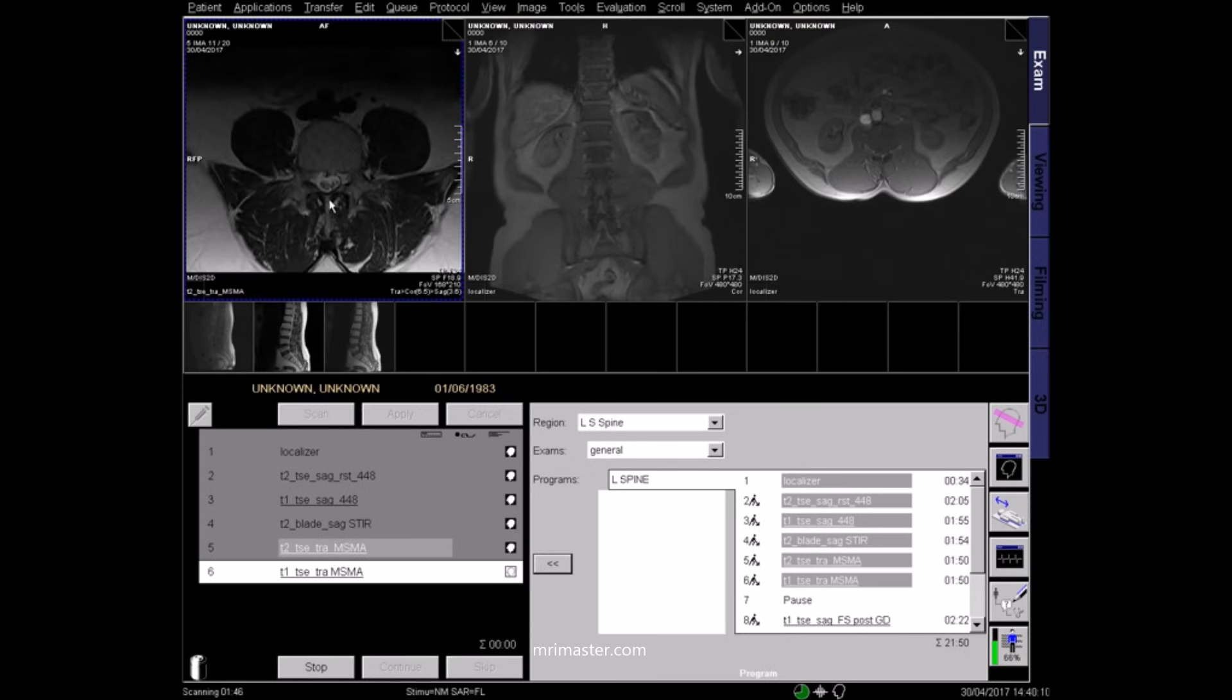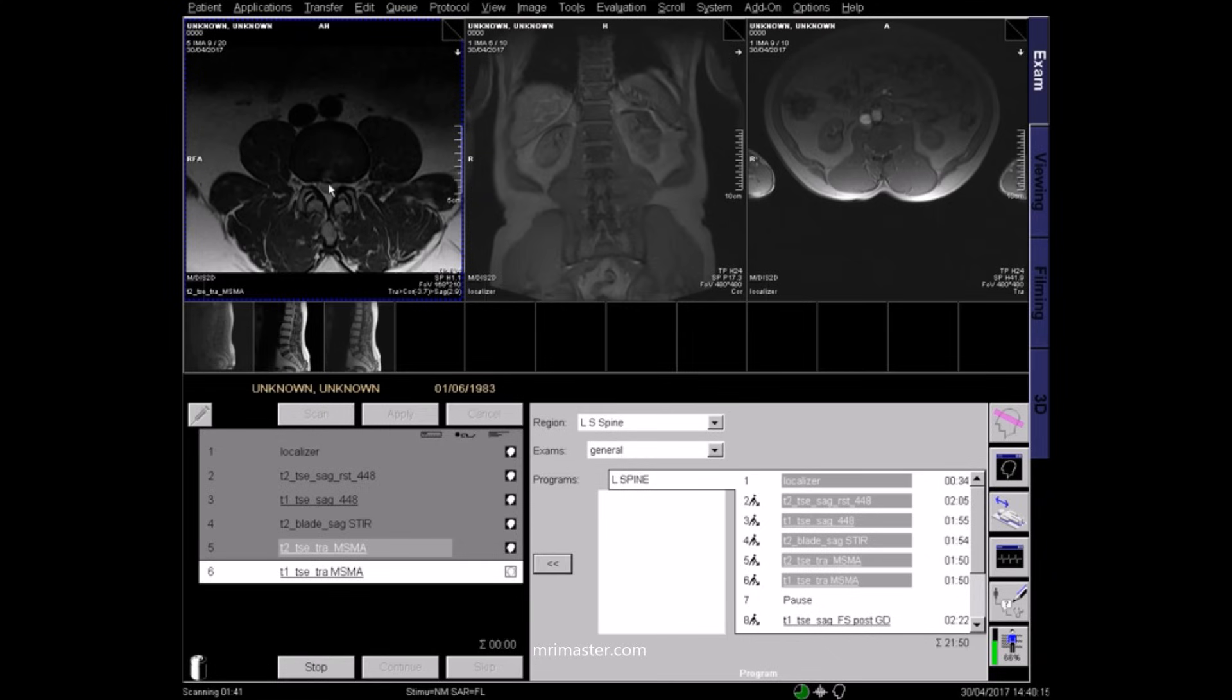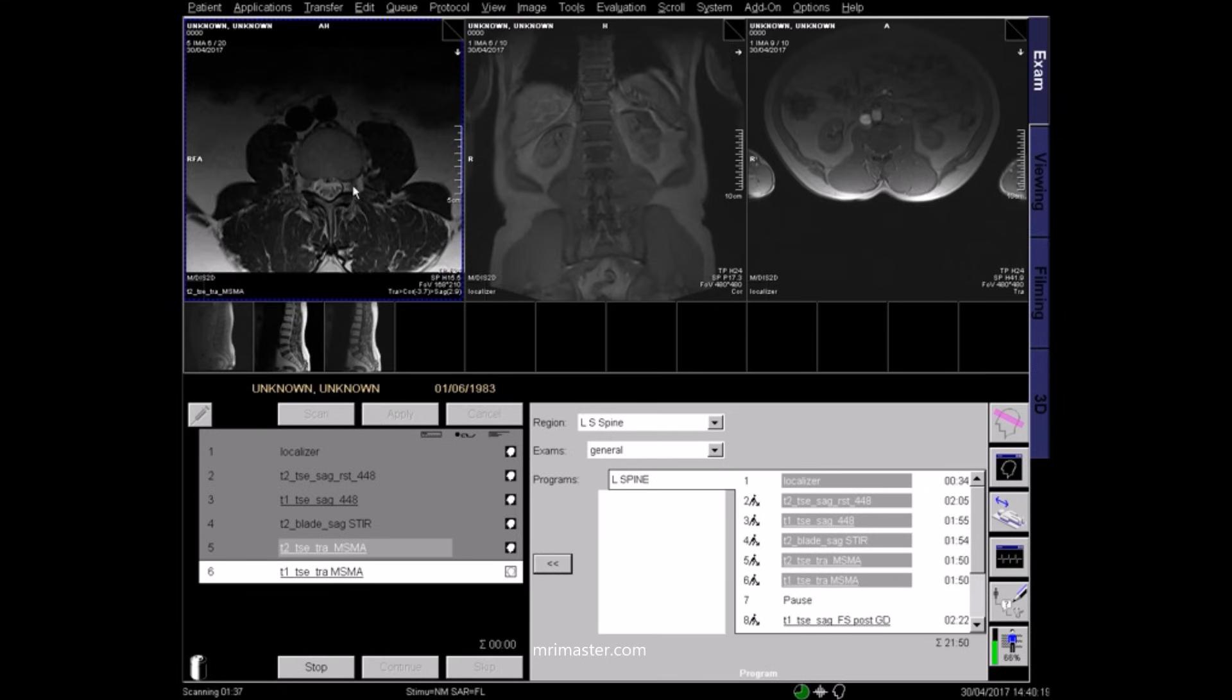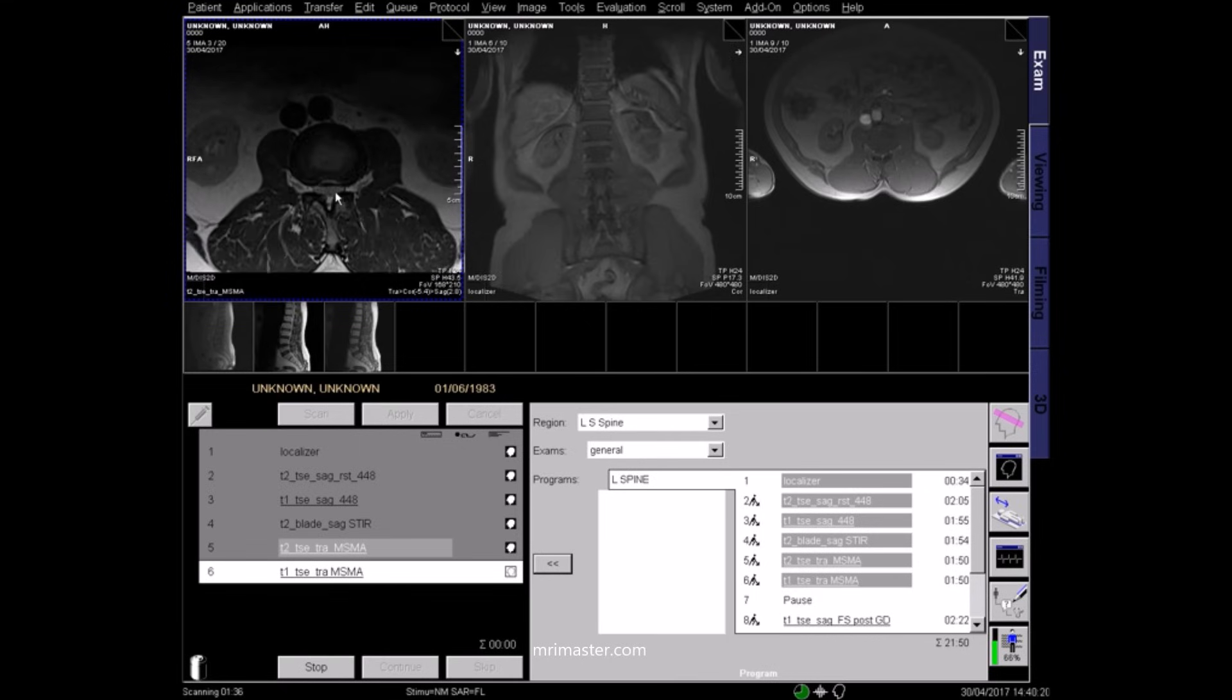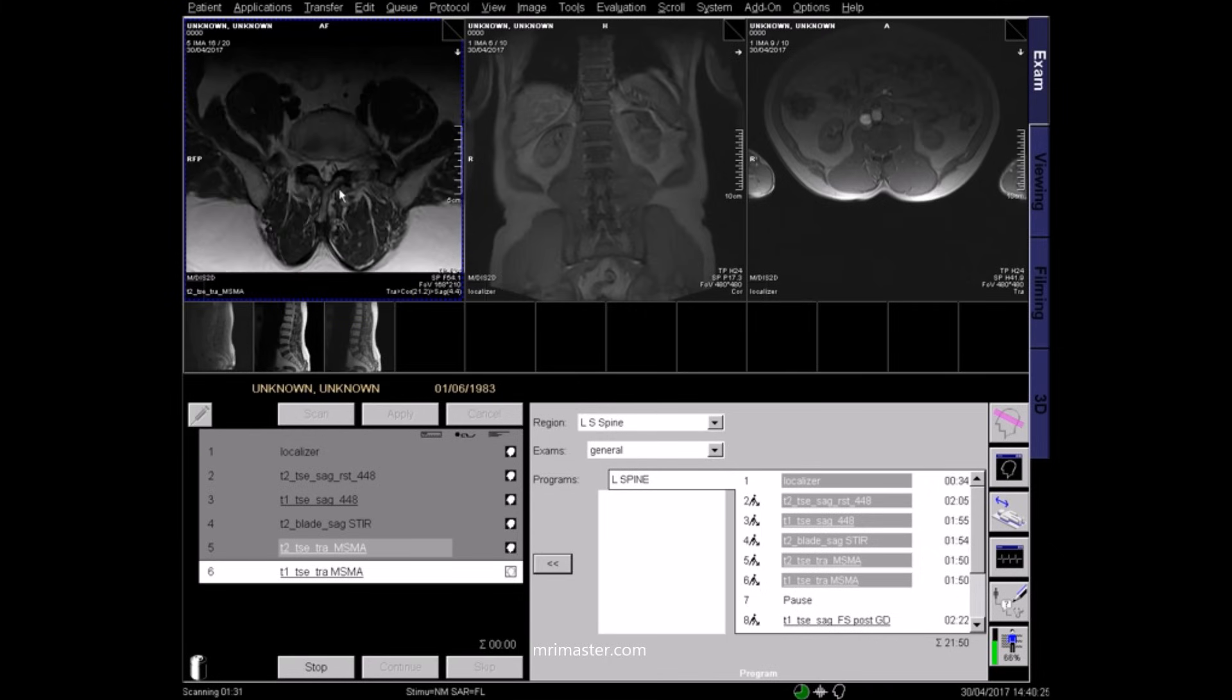This is a multi-slice, multi-angle T2 axial image. Within the bright cerebrospinal fluid, the descending spinal nerves can be clearly seen, as can any impingement of the spinal canal from prolapsed intervertebral discs.